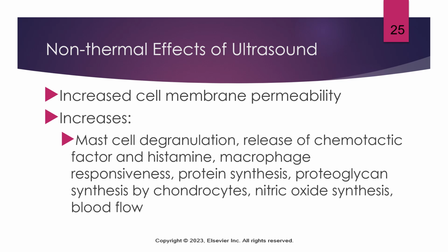It creates this rapid increase in temperature and pressure. This can damage the tissues, and it's something that's undesirable in clinical application. So in order to prevent that, we just have to make sure that we have the proper settings and the proper technique, so that we can avoid that implosion, what we call unstable cavitation. Stable cavitation is something that we do want.